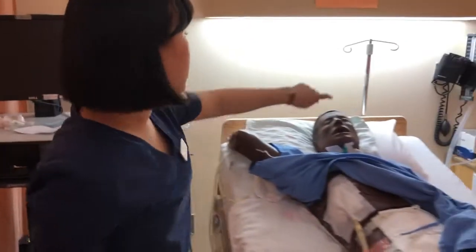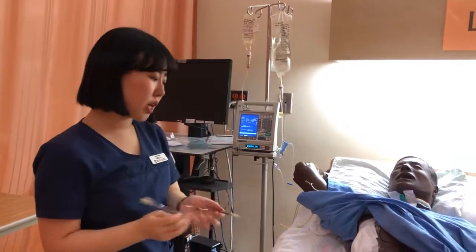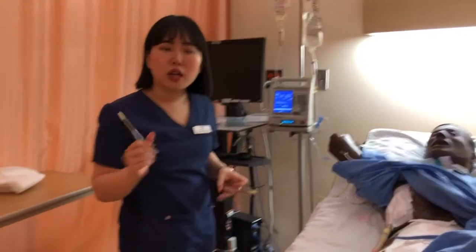And for the safety check, you're also going to check if there is sterile water at the bedside, and assess the dressing. It's not saturated. There's no blood. I see when it was last clamped. So this is for checking the air leakage.